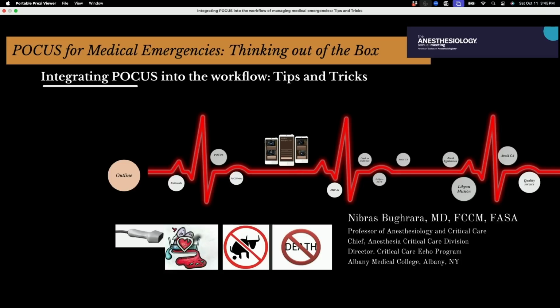And when there's only an attending or CRNA, obviously the CRNA is getting ready and intubating. The attending will do the scan and basically call off the medications used and then give the recommendations for tailoring management. So it's done in a way that it should not impede the progress. And every place might have different ways they do things. I think you cannot say this is how Nebraska does it, this is how we should be doing it.